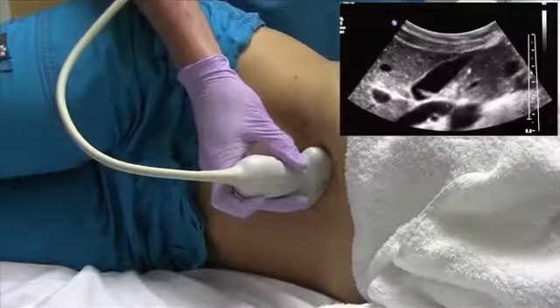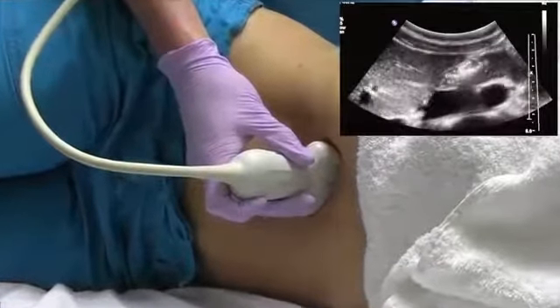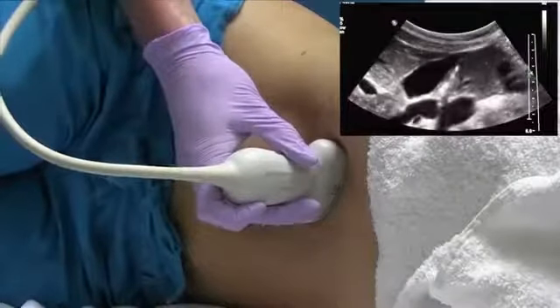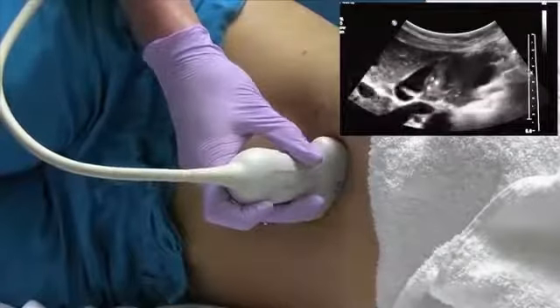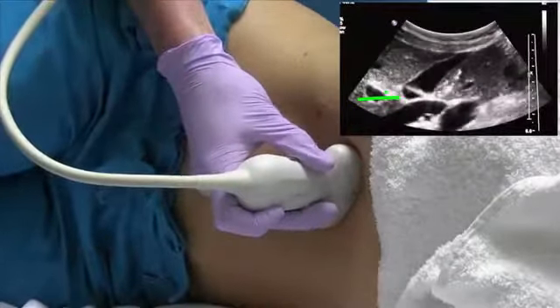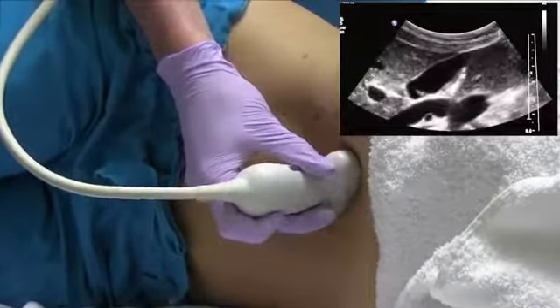You want to sweep through the gallbladder, and if there are any stones, they should drop into the fundus from this plane. This is also good for opening up the neck of the gallbladder to make sure there's no stones impacted in the neck.